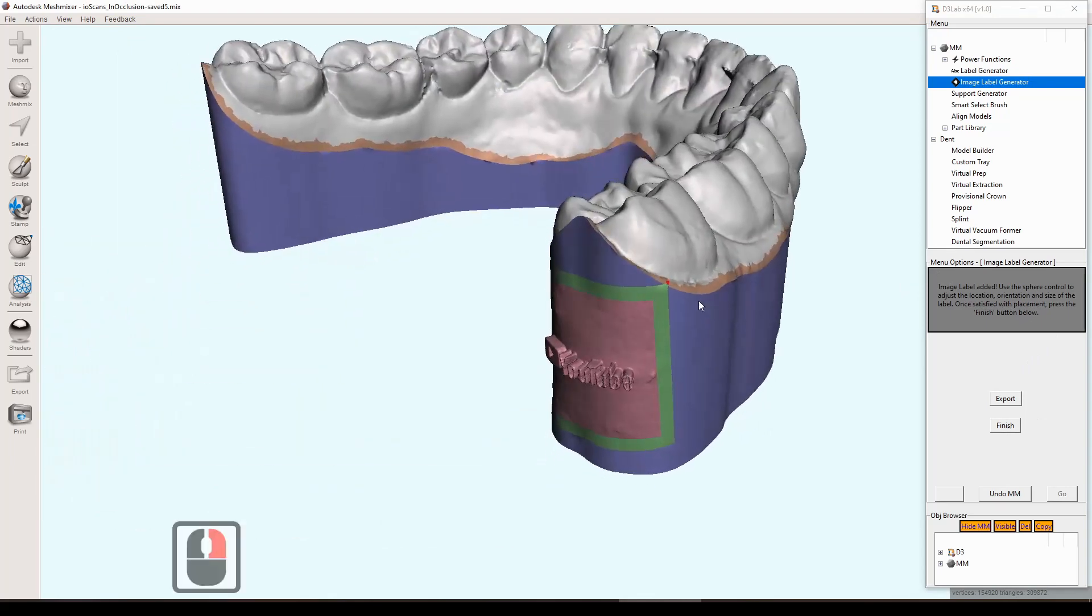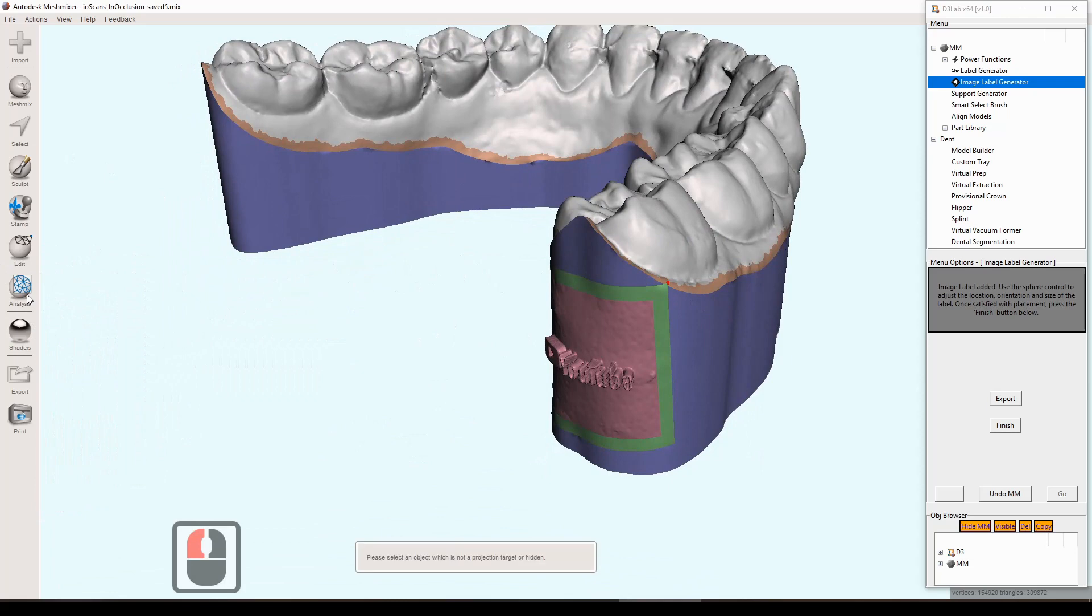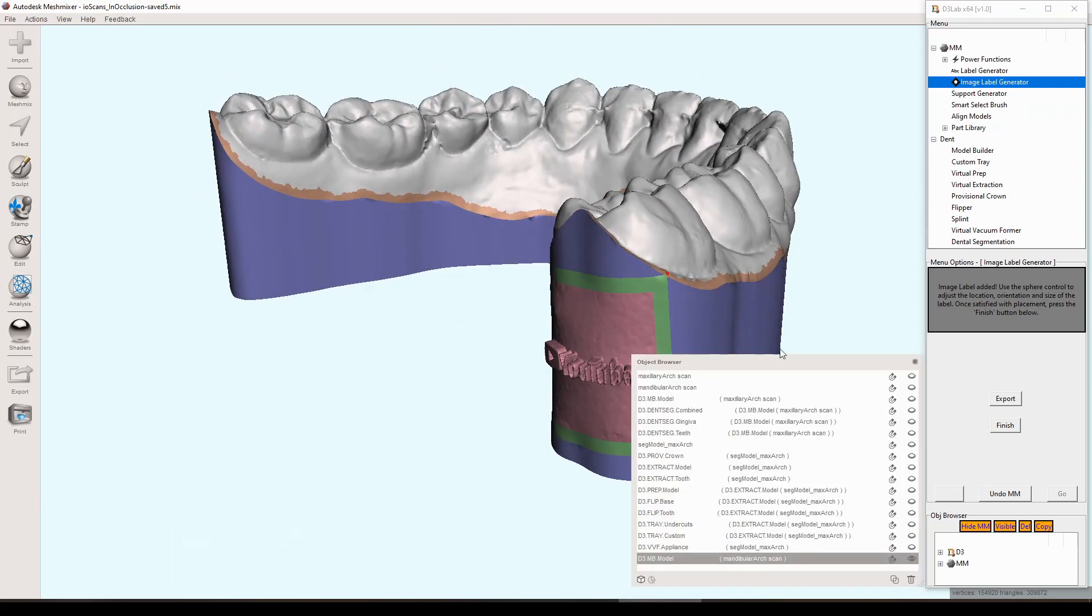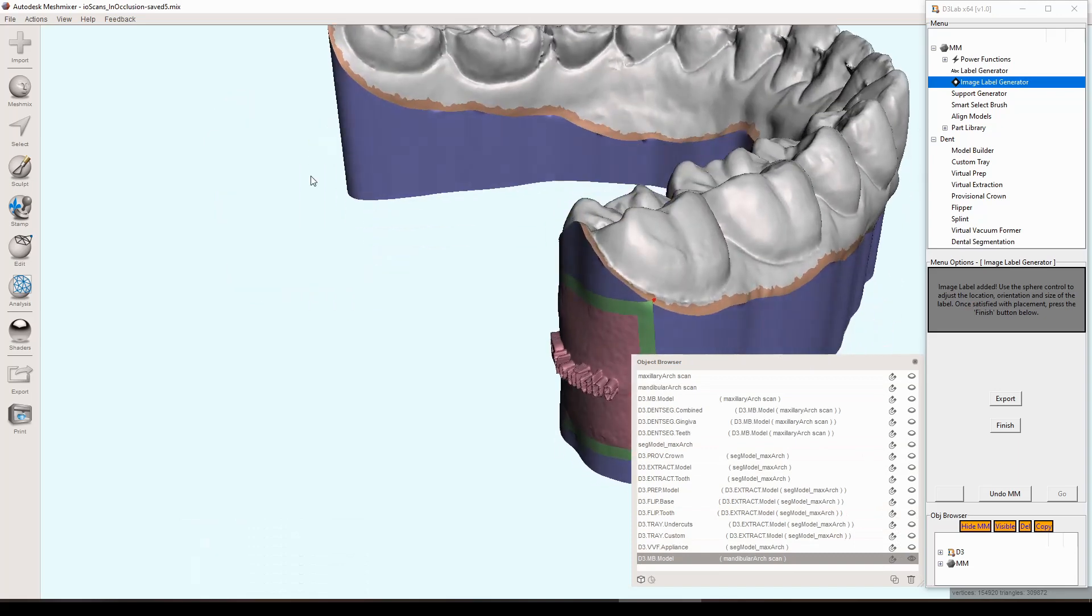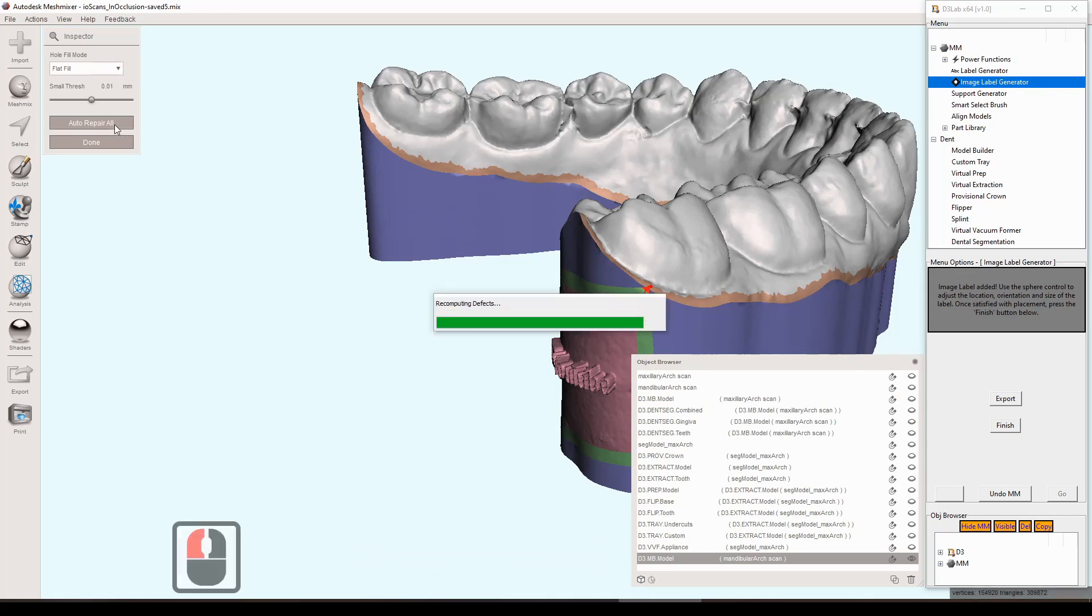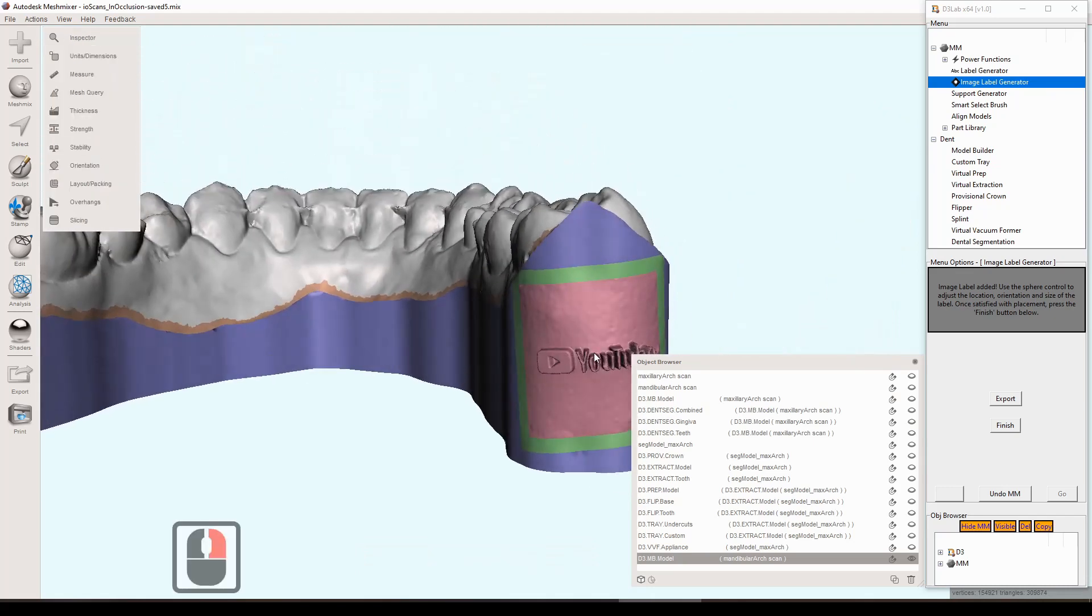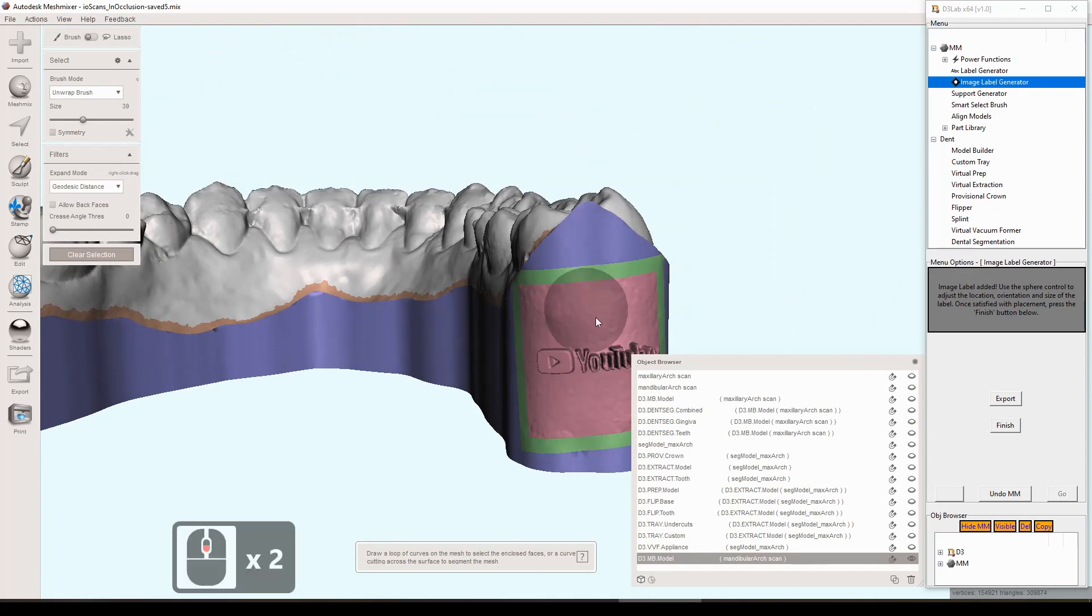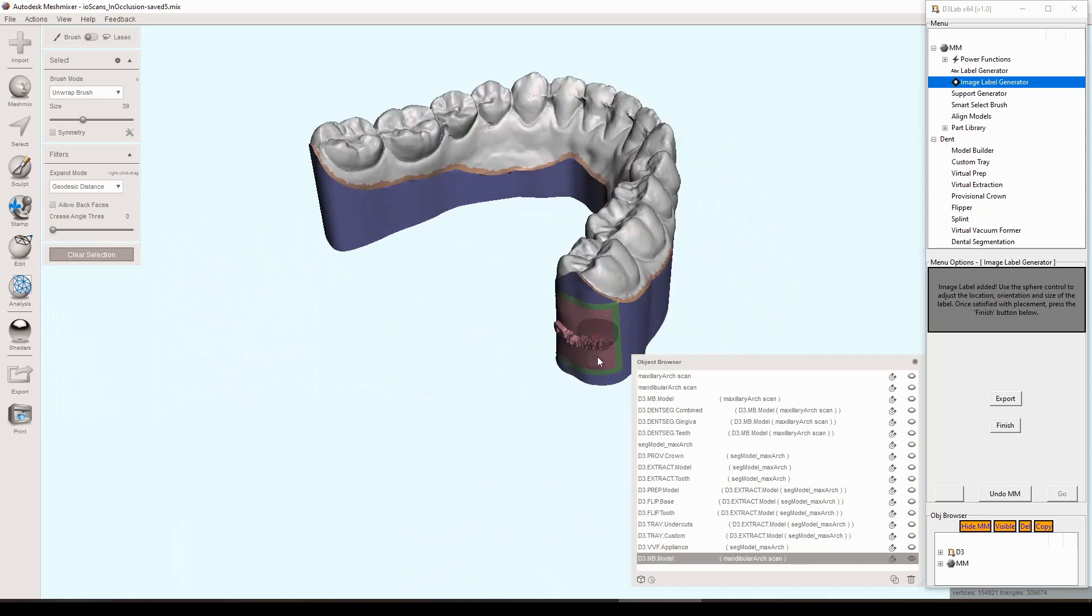That looks pretty good there. When that 3D prints it'll look nice, but I'm noticing right on the edge of where that label hits the model there's a tiny little defect that was developed. Every once in a while that does happen, so you may want to double check with the inspector when you're done doing these labels to fill those holes. The way you do that is just hit the I button with nothing selected and it will pull up the inspector tool, auto repair all, done. Even if you didn't do that, I think most printing softwares would just fill that in for you automatically when you imported it.